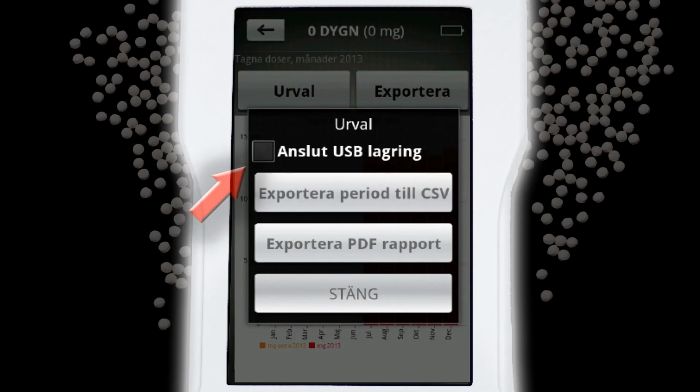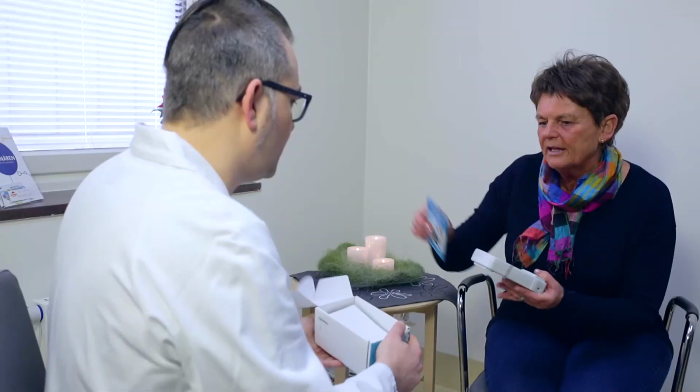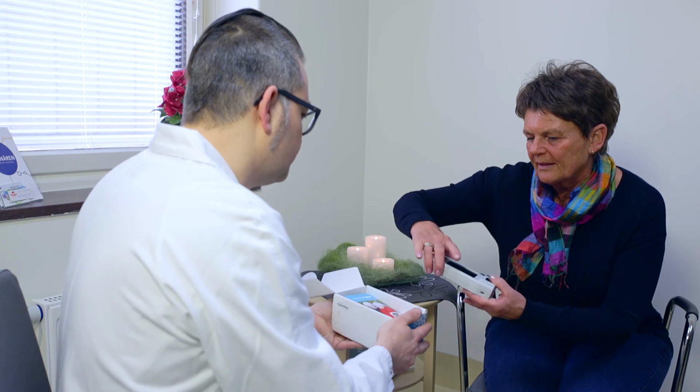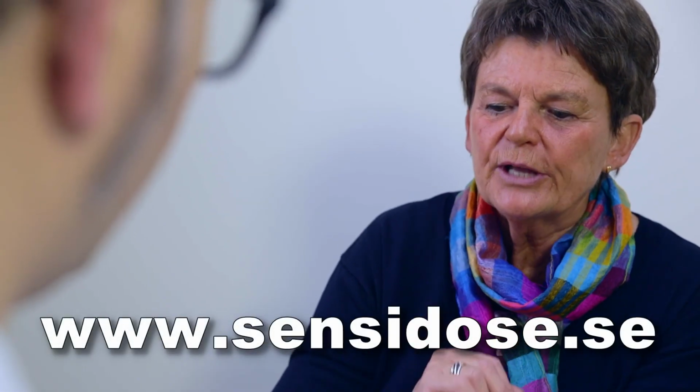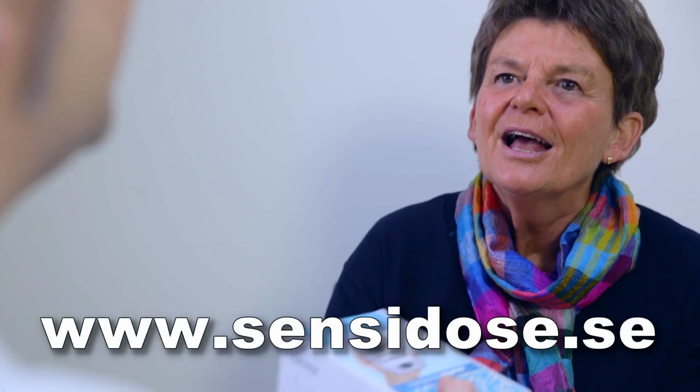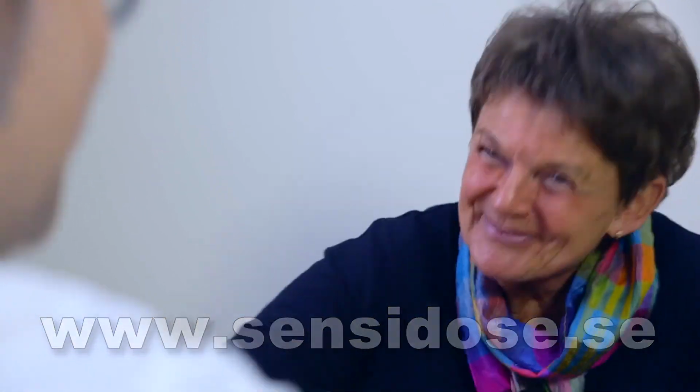After you have made your selections, click on the Connect USB storage. Then you can open the file using Windows Explorer on your PC. Data will be located in a removable disk under Computer. Save the report to your computer or print it. For further information on how to transport data, go to the website www.sensidose.se and Questions and Answers tab.